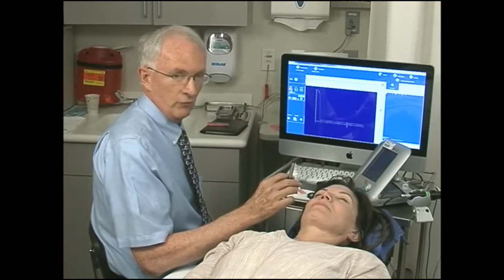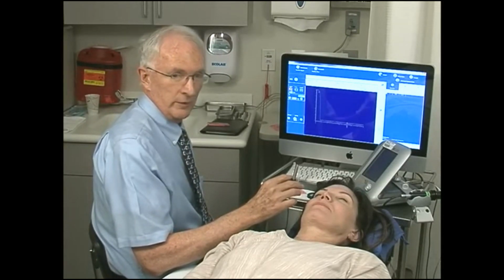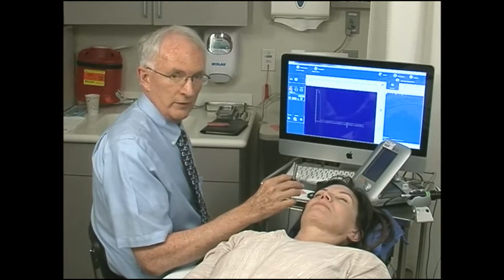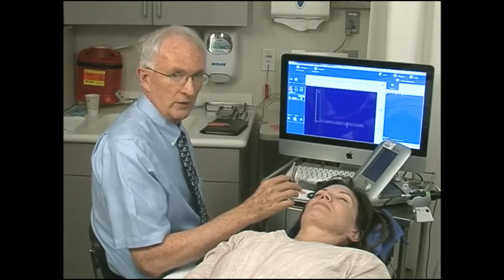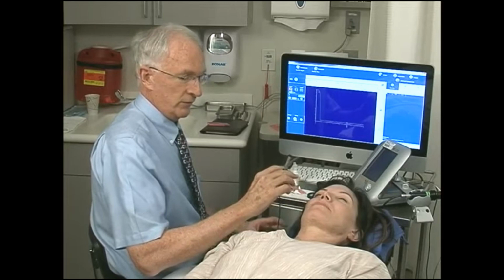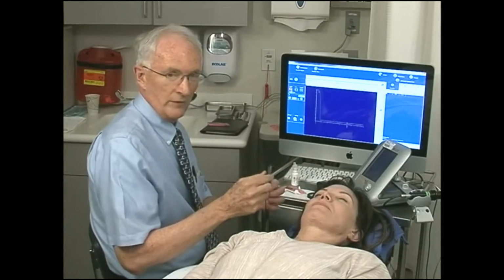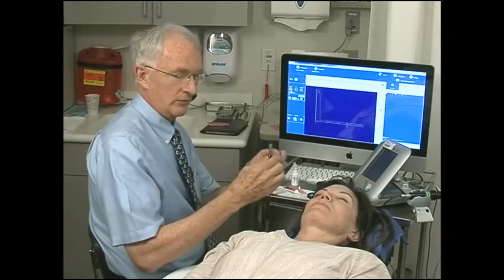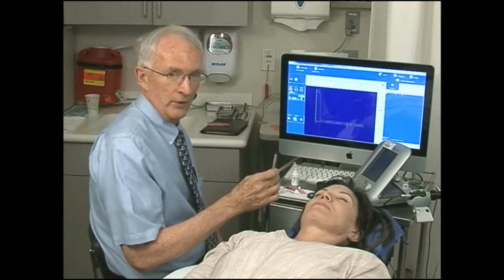This is an independent display of the A-scan only. It's very helpful for quantitation, especially in the orbit, looking at muscles, looking at optic nerve, and in the globe for looking at tumors. So to measure things, to analyze internal structure, this is a very useful technique. I will demonstrate the basic probe position. Compared to the B-scan, there is no mark on the A-scan probe, so orientation of the probe doesn't matter. It can be turned any direction, and it's the same display on the screen compared to that of the B-scan probe.